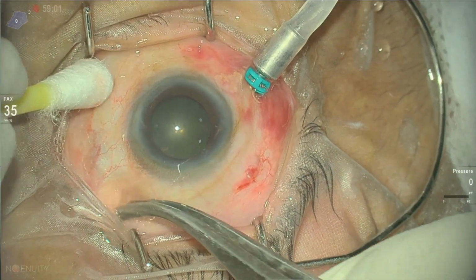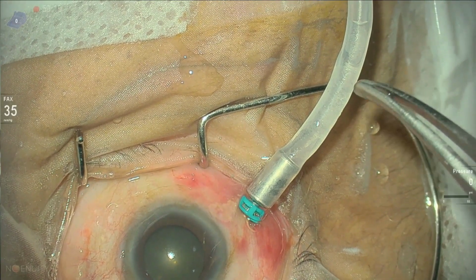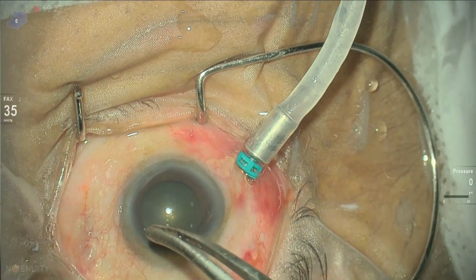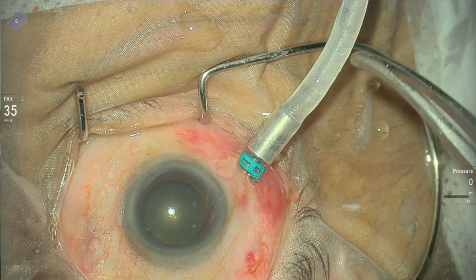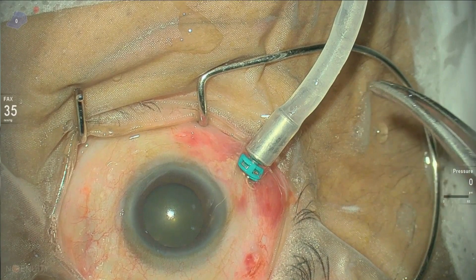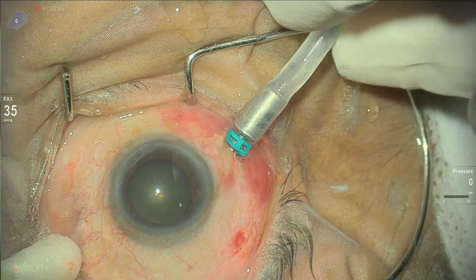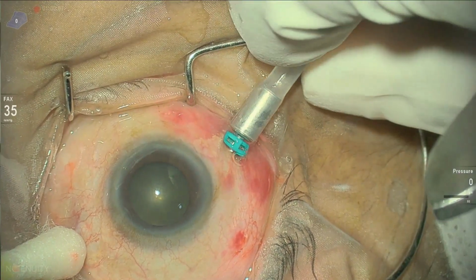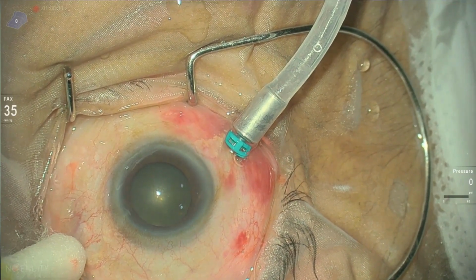After waiting for some time, once the silicone oil is seen going back into the globe, we try to push as much as possible into the globe, and once you ensure there is adequate silicone oil fill, we remove the last port along with the infusion cannula, thereby ensuring the adequate silicone oil fill.